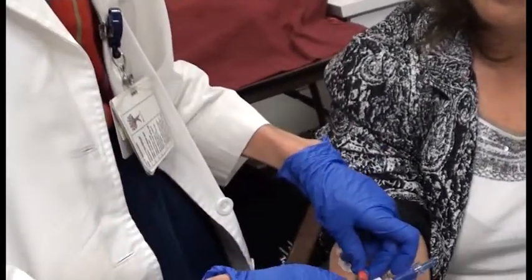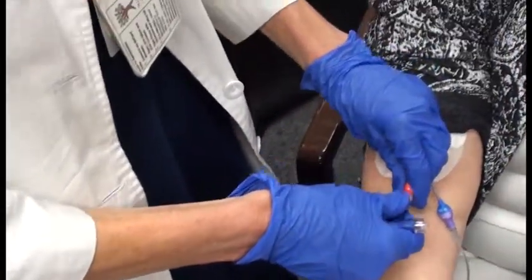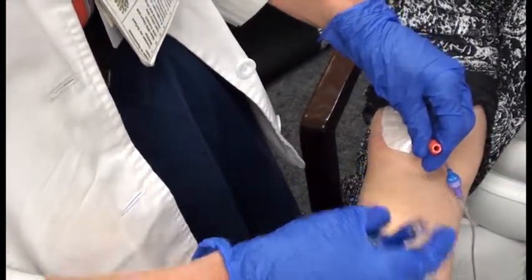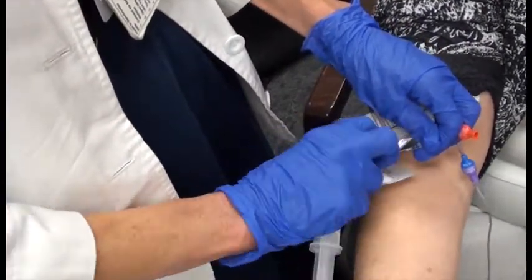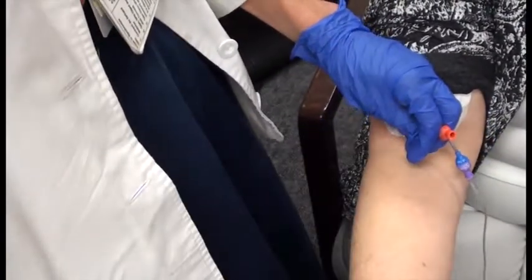All right, so we are definitely dry now. So I will get this ready. Take this off. Occasionally, it's helpful or necessary to clean this area. This looks perfectly clean. I'm not going to extra clean it. In the case of it being a little bit crusted over or something, it's okay to take an alcohol prep pad and clean that area first.